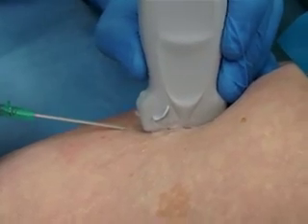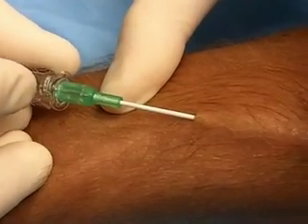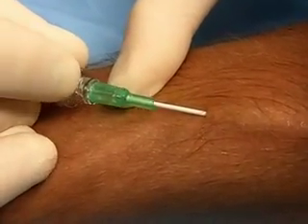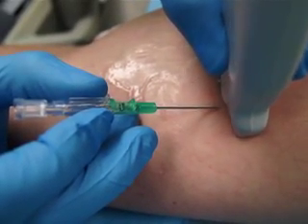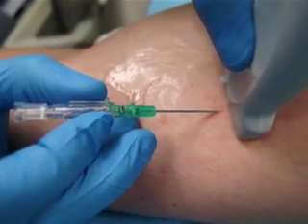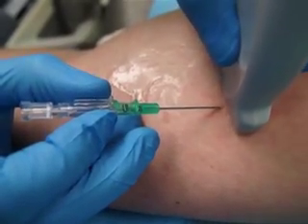the patient. We will review the proper technique for standard IV catheter placement and then demonstrate ultrasound guidance. We will limit our discussion to the upper extremity veins, but the same techniques can be used to cannulate any peripheral vein.